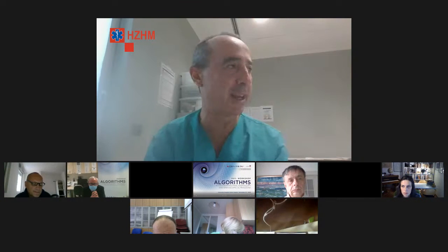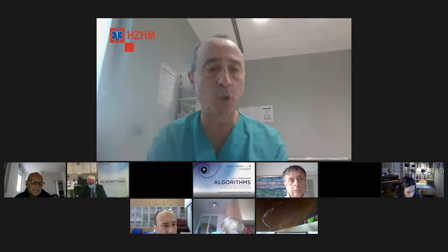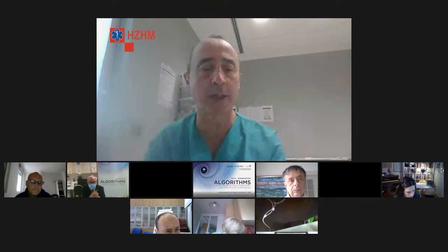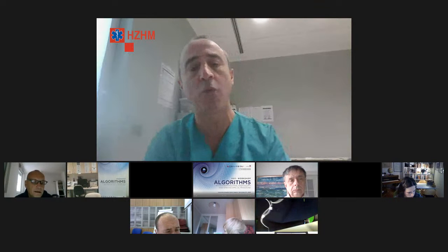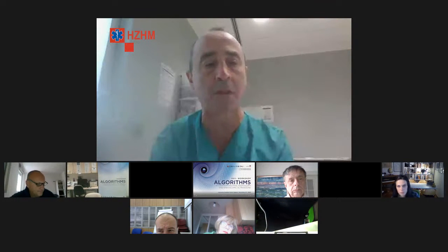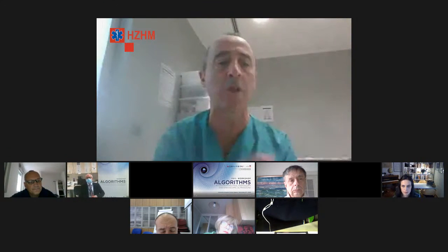That's a very good question. Technically, it's important. So we use a hybrid knife from Erbe, which allows us to inject and cut for POEM, and we use a coagrasper for coagulation of bleeding points. Finally, we use 360 resolution clips from Boston because it's very easy to rotate the clips and have a very secure closing of the mucosa. And for POES, peroral endoscopic myotomy for Zenker, we use the hook knife.